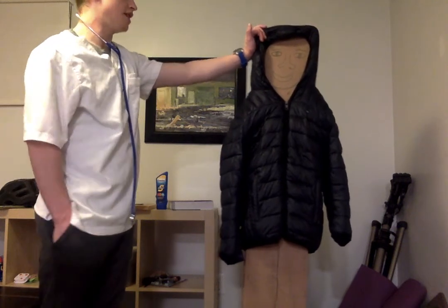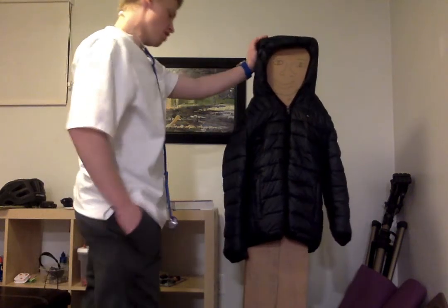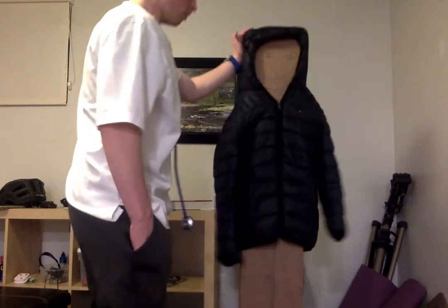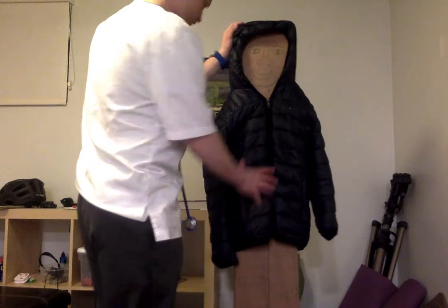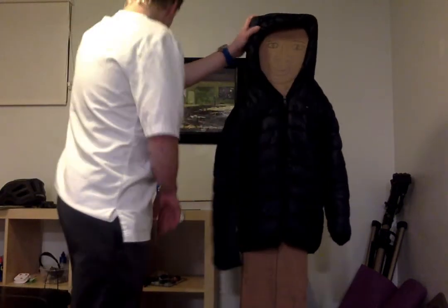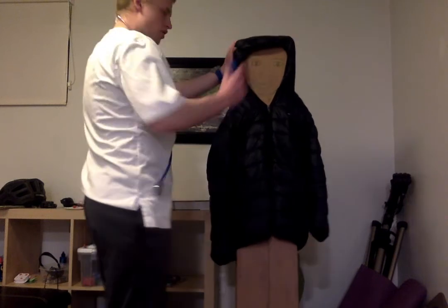Let's say he had a 72 pulse or something. Let's say the blood pressure was like 110/70. So no concerns there. We were feeling around, everything felt good. I put the pulse oximeter on him, grabbed his temperature.